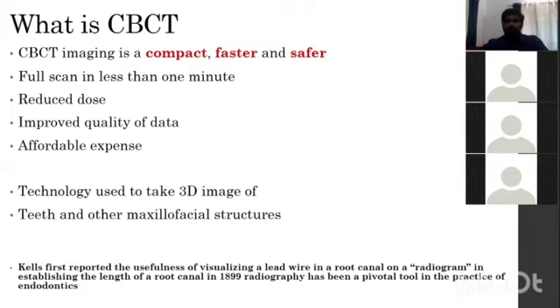It's also a safer imaging technique, as the radiation dose to the patient is very less, and it also gives very improved quality of data or image at an affordable expense for the patients. Actually, CBCT works on the principle of 3D imaging technology. By this, we can image teeth and other maxillofacial structures.